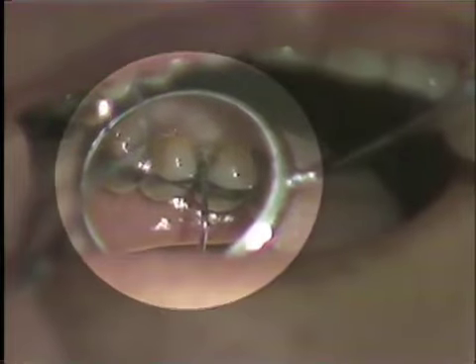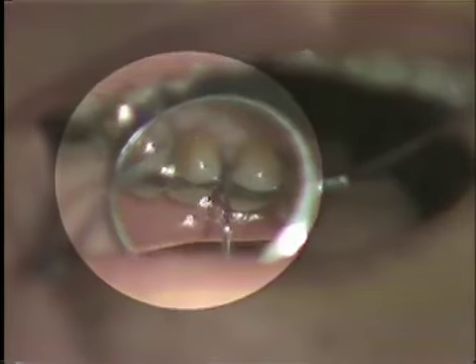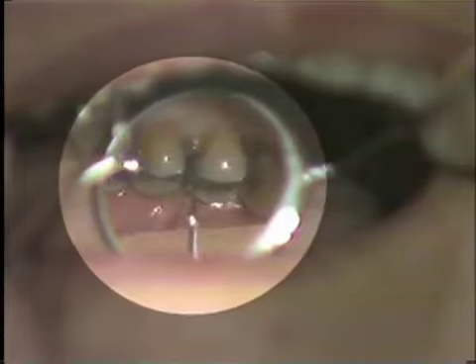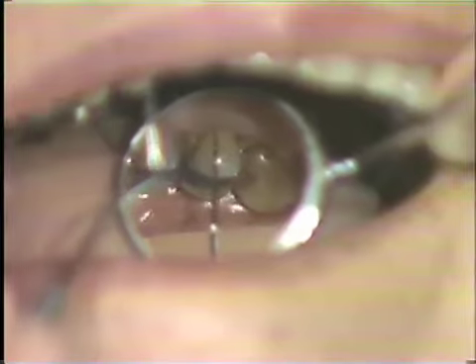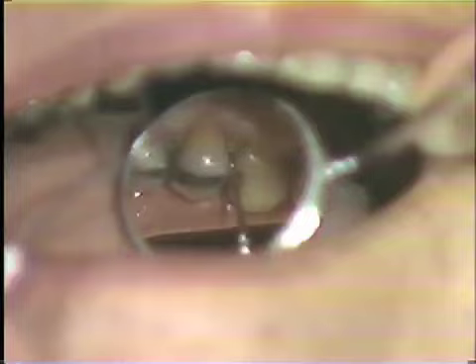Just above the surface is the 6 millimeter mark. This would indicate then that a pocket of 6 millimeters in depth is present in this area. We would continue our probing around the teeth, lingual aspect, and into the interproximal area.